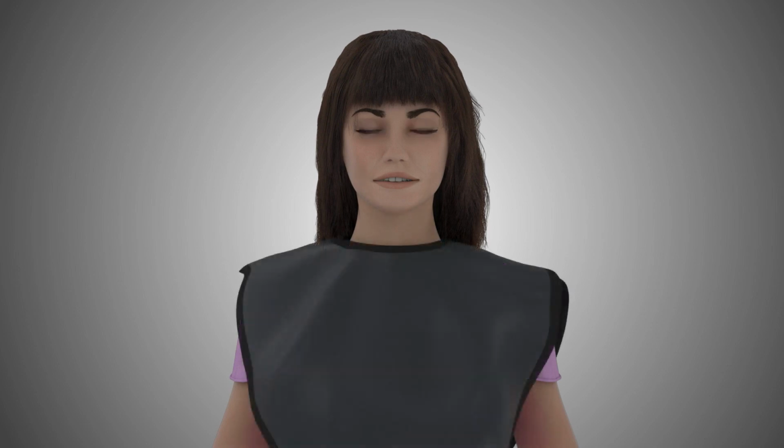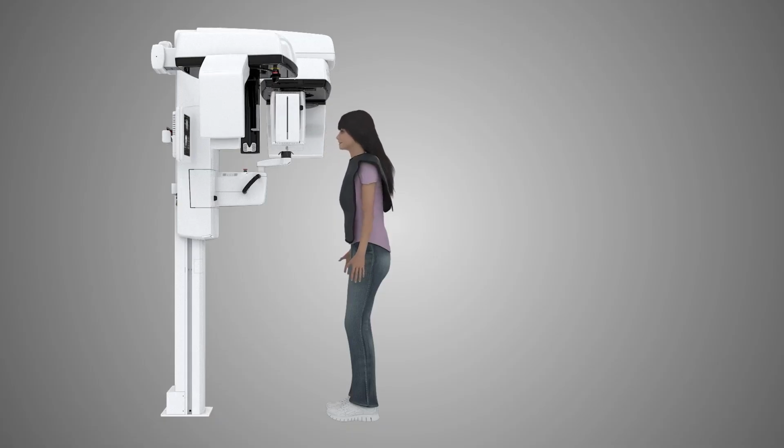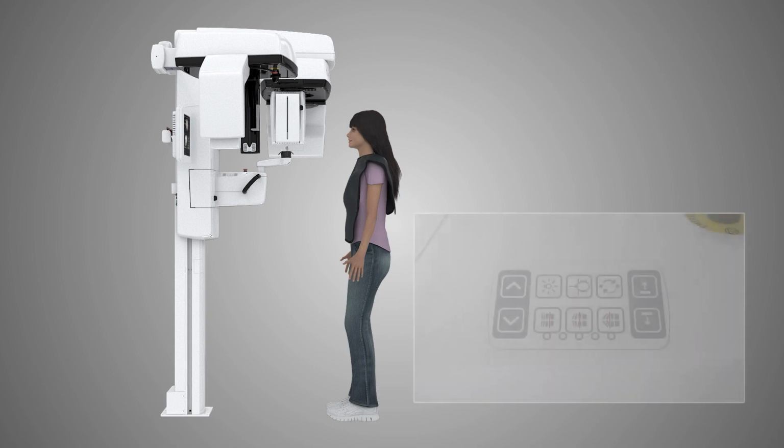Prepare the patient by asking them to remove any removable metal artifacts from the top of their head to their shoulders. These may include earrings, necklaces, hairpins, hearing aids, or other removable appliances from the shoulders and above. Properly place a protective lead apron over the patient in accordance with local regulations. Instruct the patient to stand as straight and tall as possible in front of the unit for preliminary alignment.